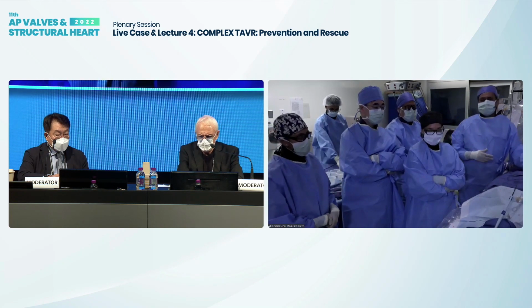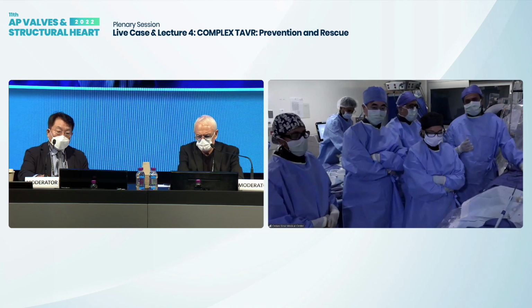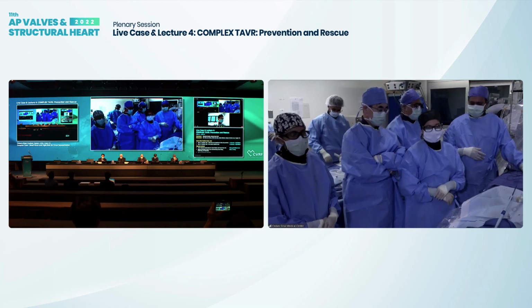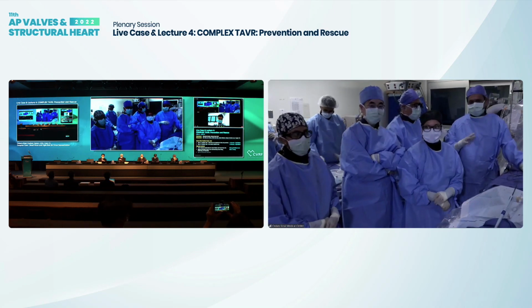So we have planned to show you a couple of cases, and we will start with this bicuspid case. It's not an easy case. Let me go ahead and introduce our team.